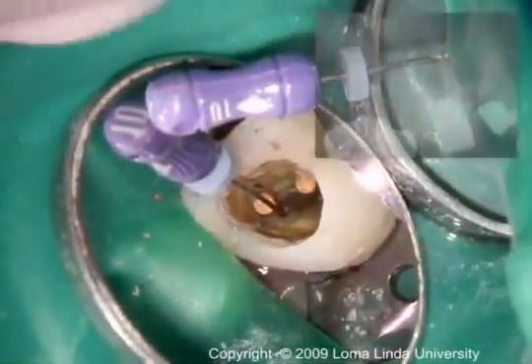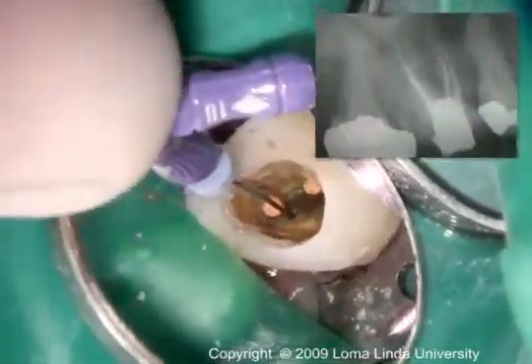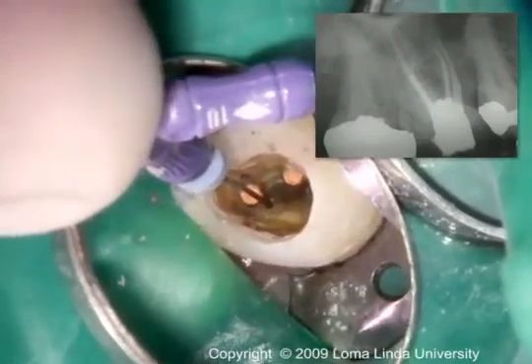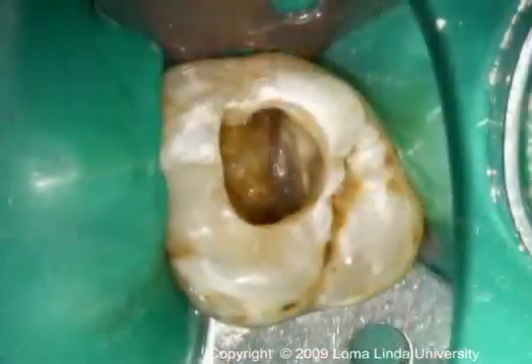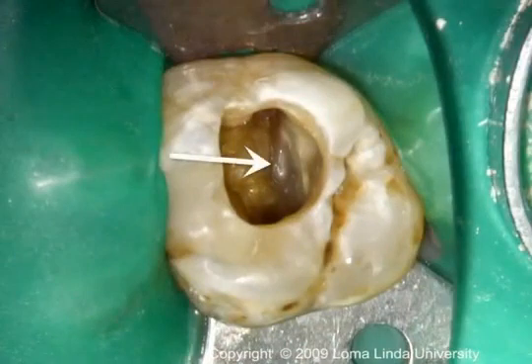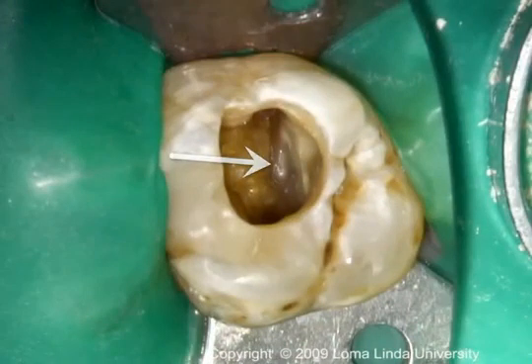The orifice of the mesiolingual canal is located 1–3 mm lingual to the main mesiobuccal canal. It is slightly mesial to a line drawn from the mesiobuccal to the palatal canal.